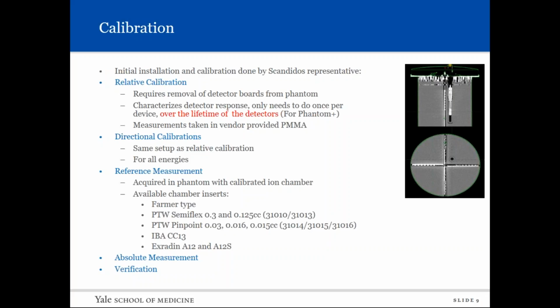the ion chamber inserted to get an absolute reading, and then irradiating at different gantry angles and relating that reading to the diode reading. So it's a pretty simple process, takes 30 to 40 minutes each machine. Of course, you should always verify these measurements with some plans afterwards.